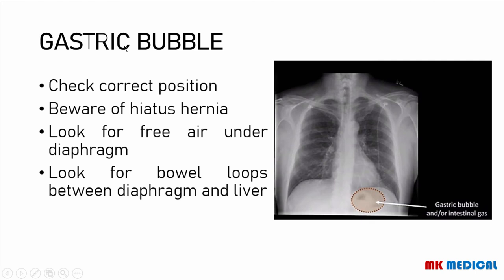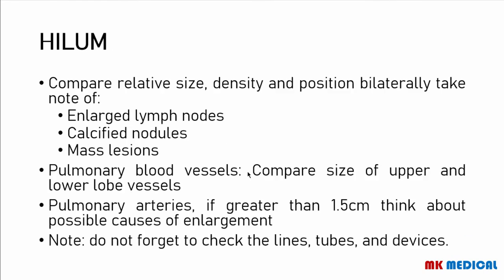Moving on to the gastric bubble — remember that the gastric bubble is usually going to be found on the left side below the diaphragm. You should be aware of hiatyhernia, which I showed in the first two review lecture videos — go back and watch those if you missed that. You may sometimes look for any free air under the diaphragm, but be aware of a sign known as the Chilaiditi sign — this is simply a bout of bowel loop between the diaphragm and the liver, which you can mistake for a pneumoperitoneum.